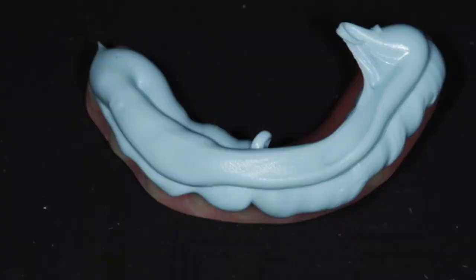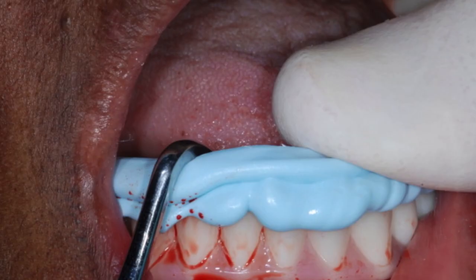So you got the blue mousse on top. This is just to protect the denture teeth because you're going to use the seating tool here because you're listening for a click as you do this. Correct. You said you start in the posterior and work your way towards the anterior. Correct. And when these snap into place, it's a fair amount of effort to get this down, which is why it's fixed to the patient. Yes. The reason we use the blue mousse is to protect the acrylic teeth from chipping.